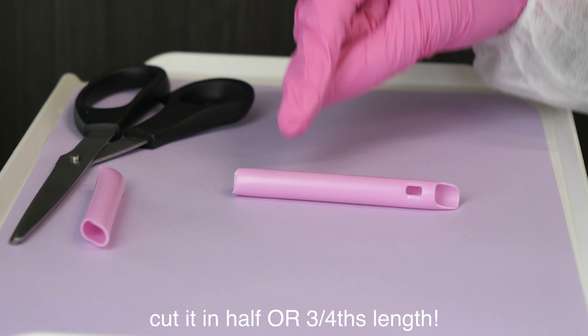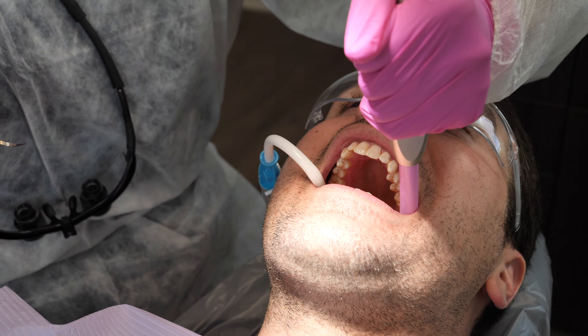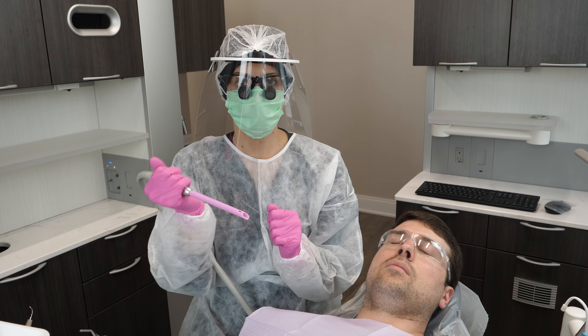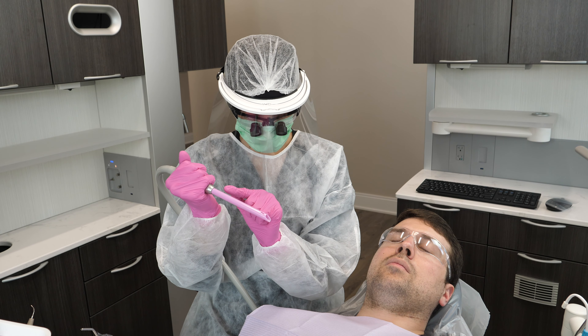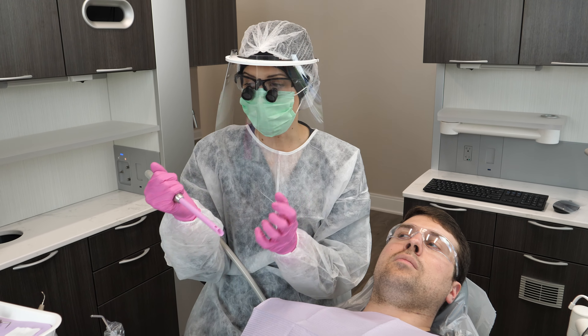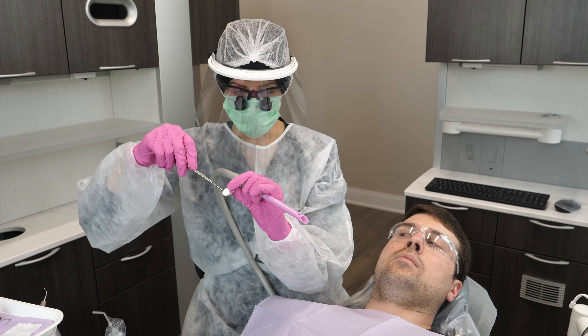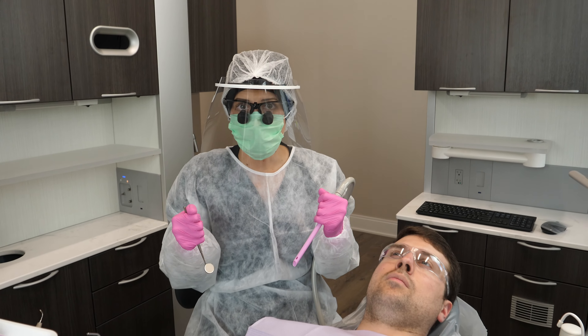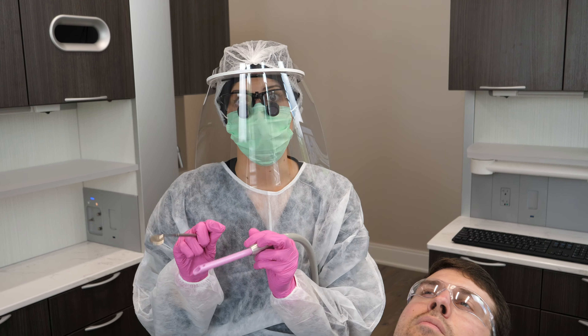One: cut it in half. You have so much better control when it's shorter, and it's easier to retract the cheeks and the tongue. Two: get one with a mirror on it. Some actually look like this and have a mirror in the suction, and some actually look like a mirror with suction all around them. I've heard great things about both and I'm really eager to try both of them soon.